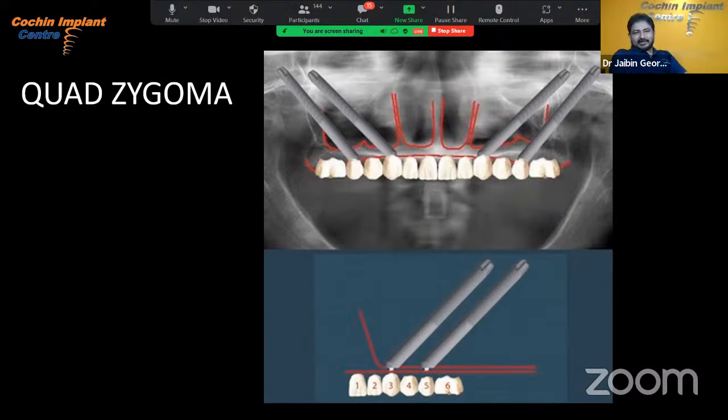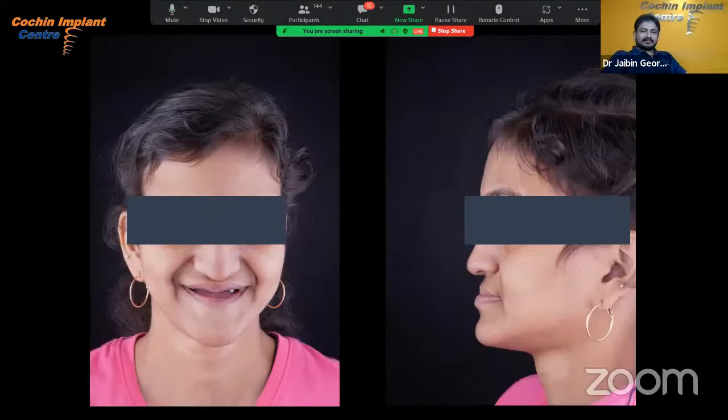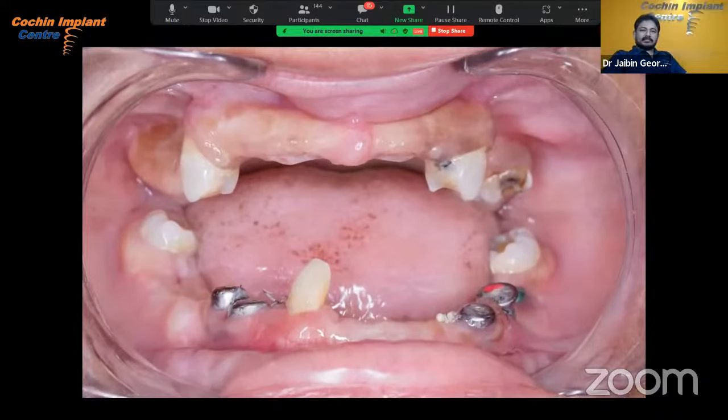Now, I want to share a quad zygoma case where there is no bone in all the three zones of the maxilla. The only option is called extramaxillary implants, where we place quad zygoma, two zygomas on each side. This is the patient. She was partially edentulous from birth. There was no teeth.